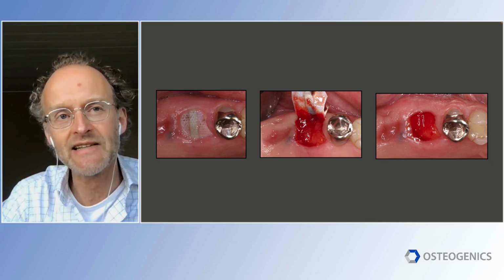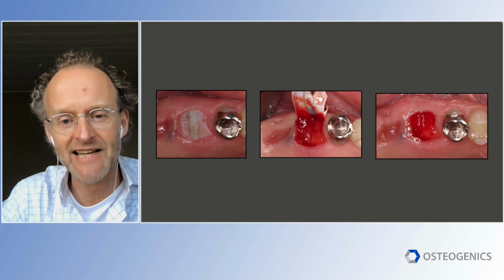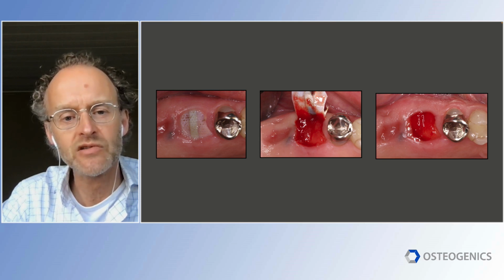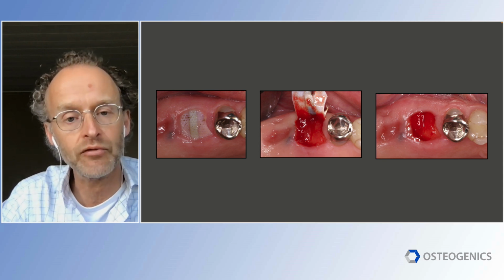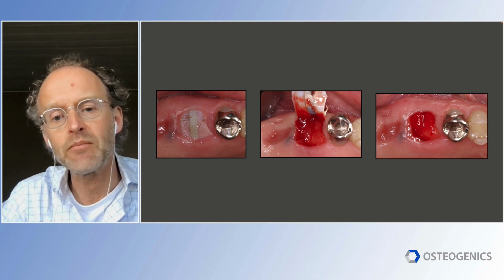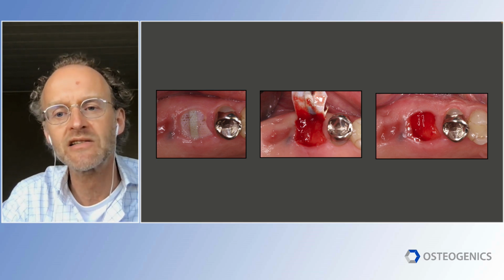These three slides I really like. I tell you why, because it's linking science with daily practice. That's what I really like. On the left side of your screen, you see the second molar at 6 weeks and the tissues are already collapsing. We know from the review of Hammerley that it will continue. On the right, you see the membrane is just taken out and all the borders are keratinized tissue.